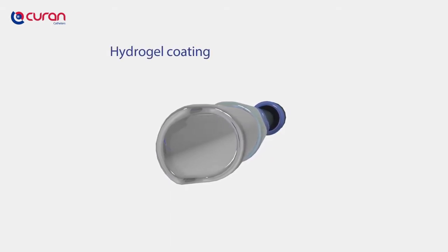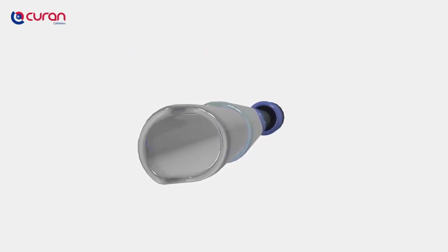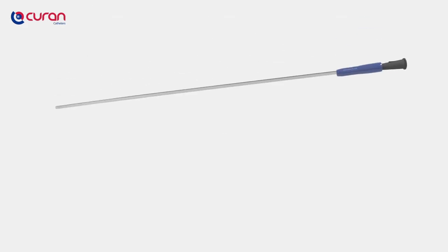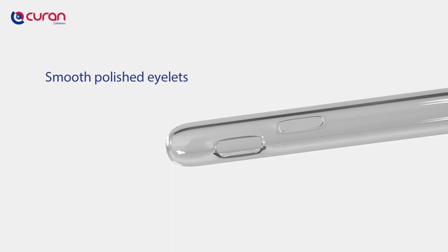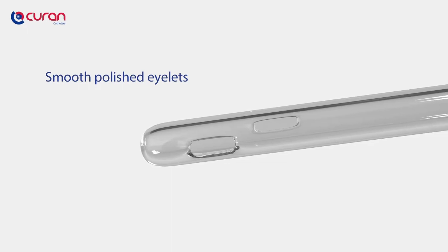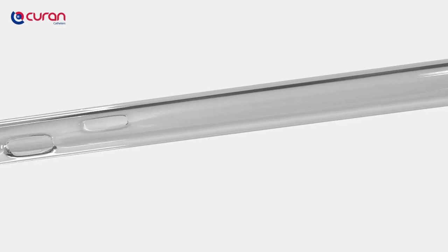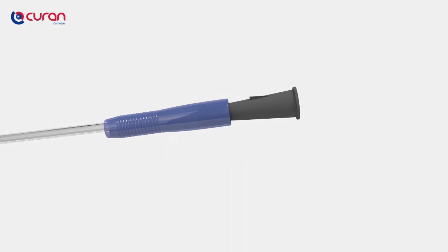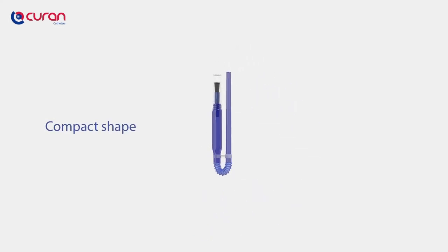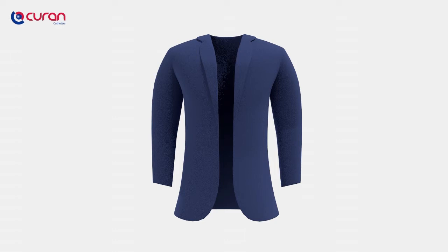The hydrogel coating is directly ready-to-use, is mess-free and does not spill any liquids. The Curan Man features very smooth, fire-polished eyelets, which makes insertion risk-free and prevents irritation, and are free from all aggressive softening agents such as DEHP. It features a universal, colour-coded, soft and flexible connector which fits all types of urine bags. The Curan Man is easy to store in a pocket or bag and can be disposed of easily after use.